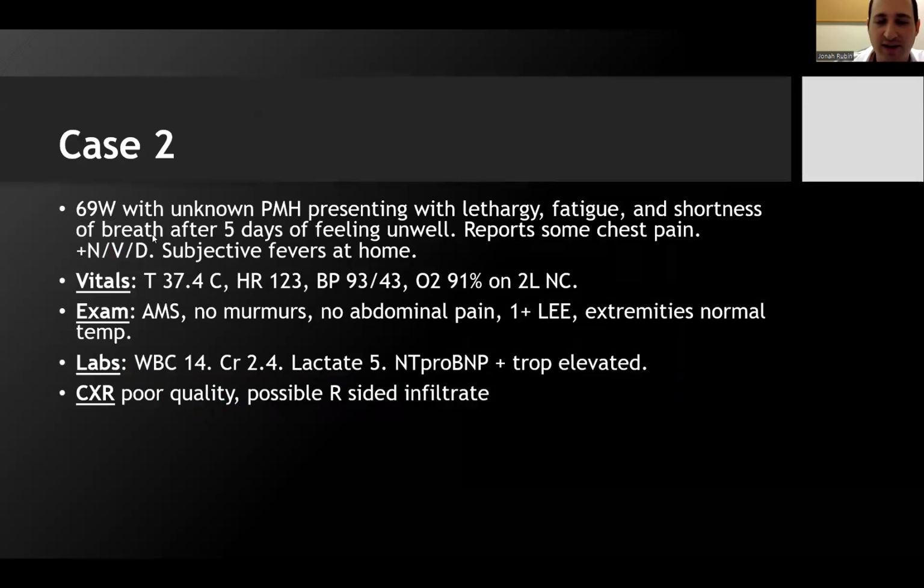All right, so case number 2 of 4. So very similar case. This is a 69-year-old woman with an unknown past medical history with lethargy, fatigue, and shortness of breath after 5 days of feeling unwell with some chest pain, nausea, vomiting, and diarrhea. Same vitals, same exam. X-rays poor quality, maybe there's a right-sided infiltrate.